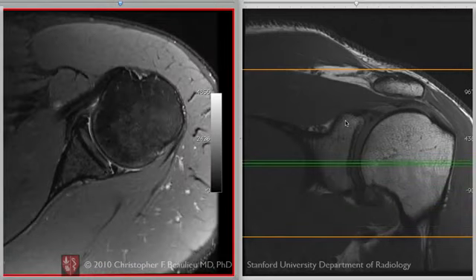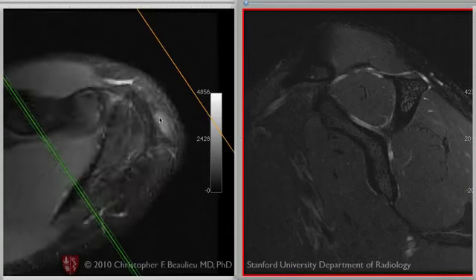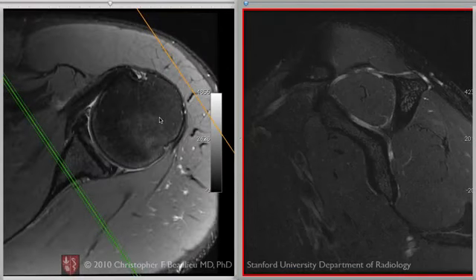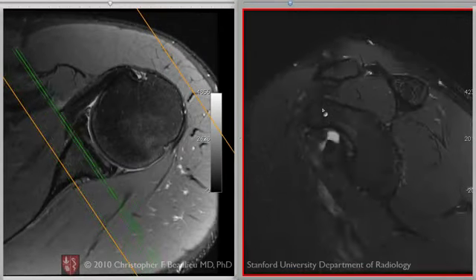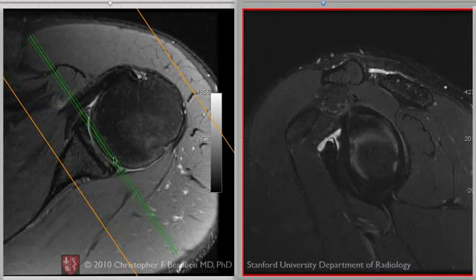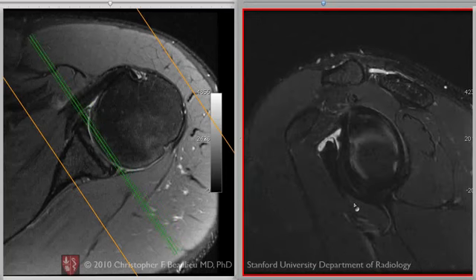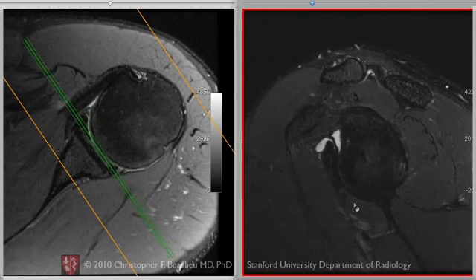I'm going to switch this one to the sagittal image for a minute. Now I've switched to the sagittal orientation here on the right-hand panel, and if we're in the plane that's parallel to the glenoid face here, you can see the glenoid itself. This is anterior, posterior, superior, and inferior.